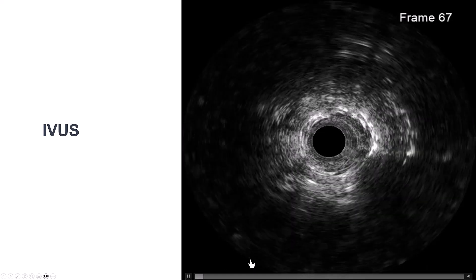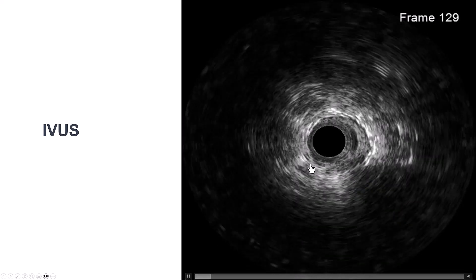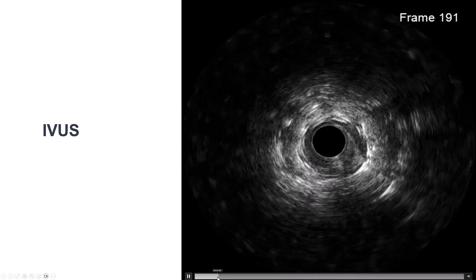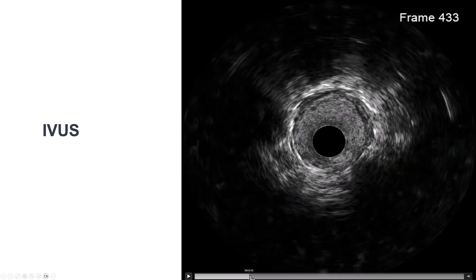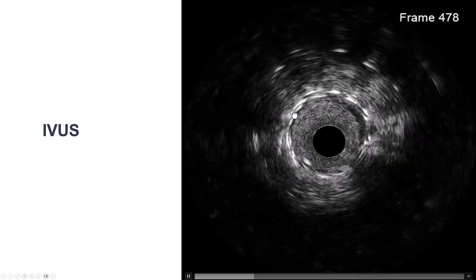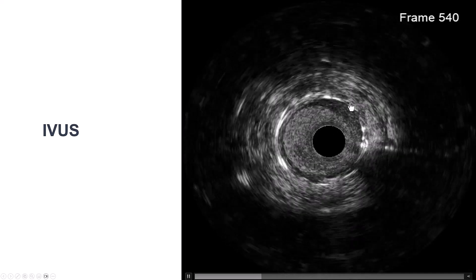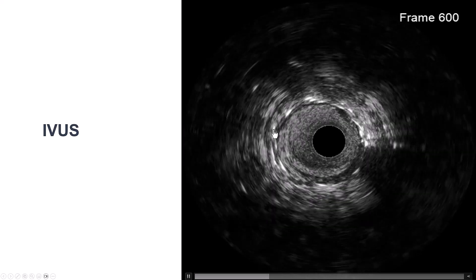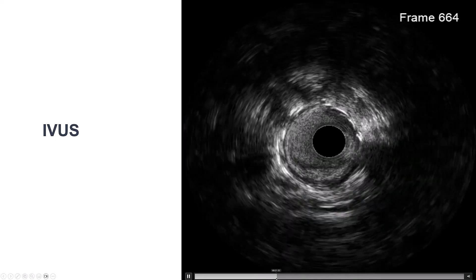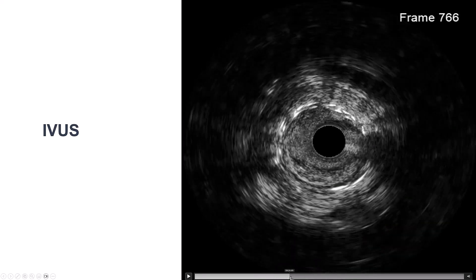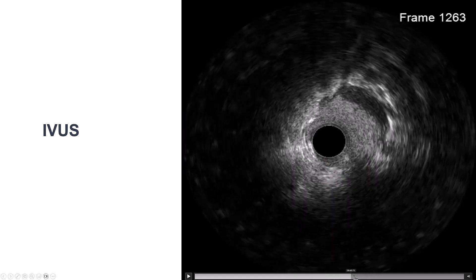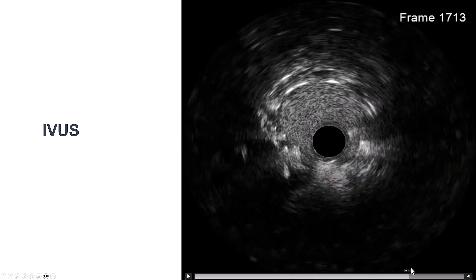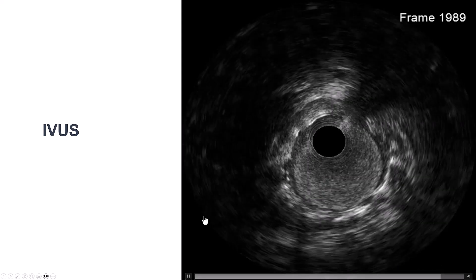So to clarify this more, we did intravascular ultrasound. We do see quite a bit of neo-intima formation. The old stents seem to be well expanded. There are actually multiple layers of stents — at least two and maybe even three layers. But again, now we've restored flow through most of the LAD.